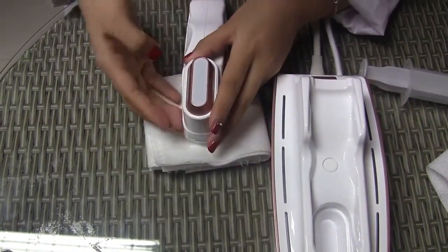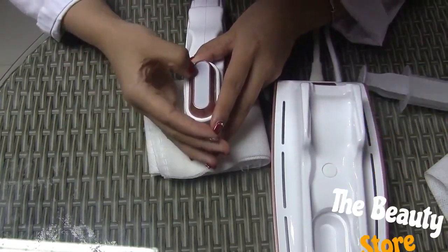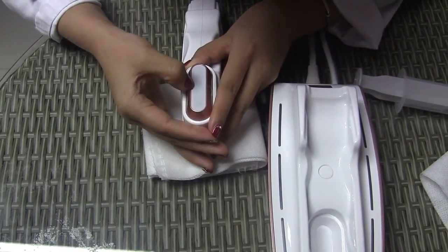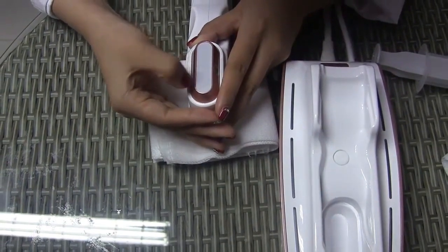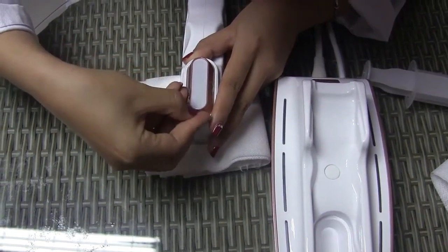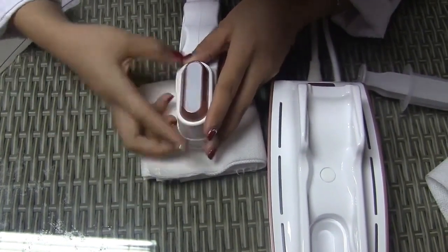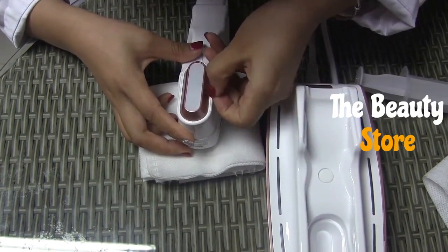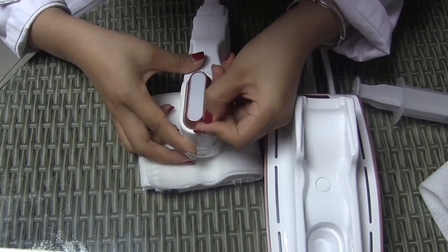Okay, when we put it on, we need to press it in this way, not in this way. This way is not correct. In this way. Remember, there is one protective membrane on this membrane. You need to tear it off, otherwise you cannot use it.